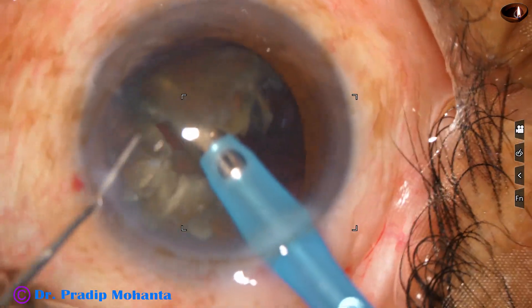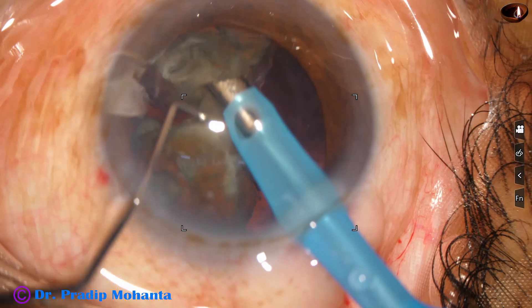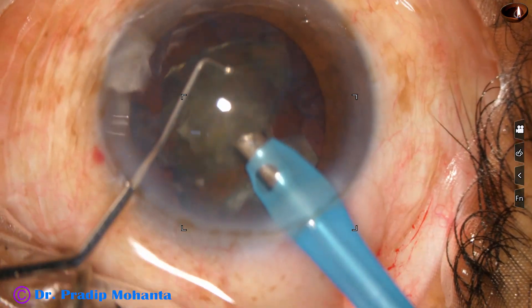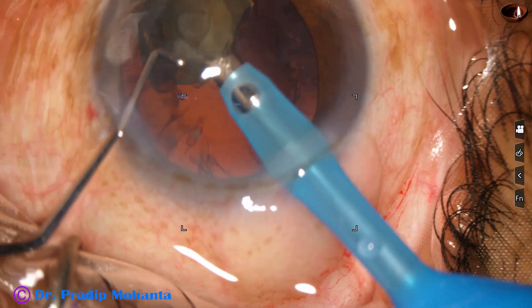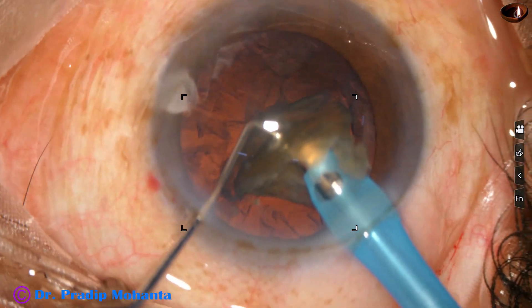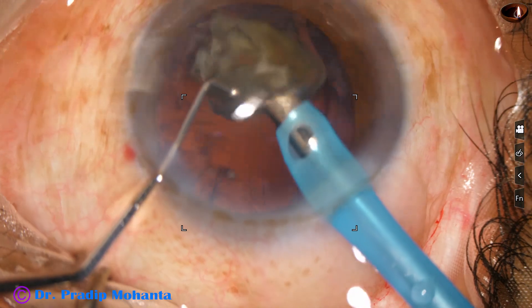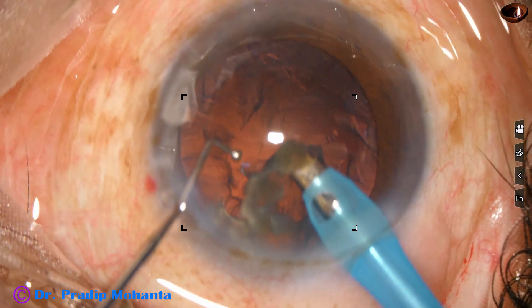Phaco settings: the ultrasonic power is set at 80 percent, but how much I deliver depends on how much I press the foot pedal. I always press in such a way that no cavitation bubbles occur. Towards the end of the surgery for the last piece, the parameters are reduced — ultrasonic energy is brought down to 60 percent, flow rate to 35, and vacuum to 350. Before that, for chopping and emulsification of other pieces, vacuum was 450 mmHg and flow rate was 45. During emulsification of the last piece, we have to be gentle, cautious, and do it slowly.